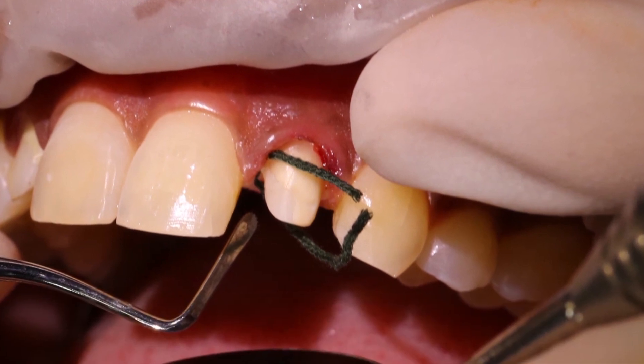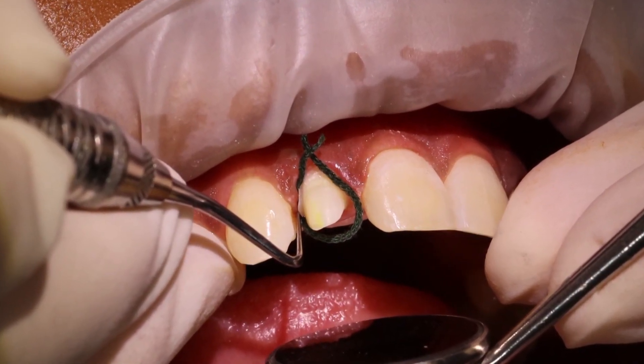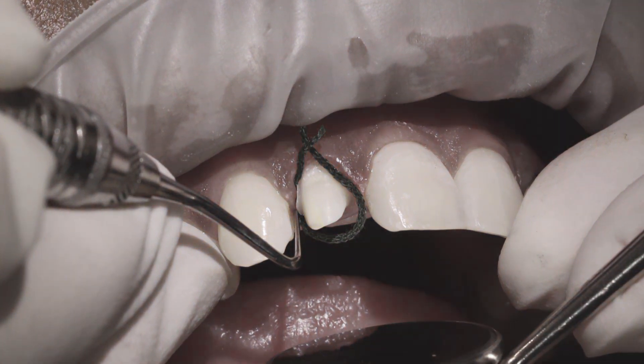If placing cord before cementation, ensure it's packed deep enough beyond the margins. Otherwise, cord getting trapped under your restorations would be a very bad day at the office.